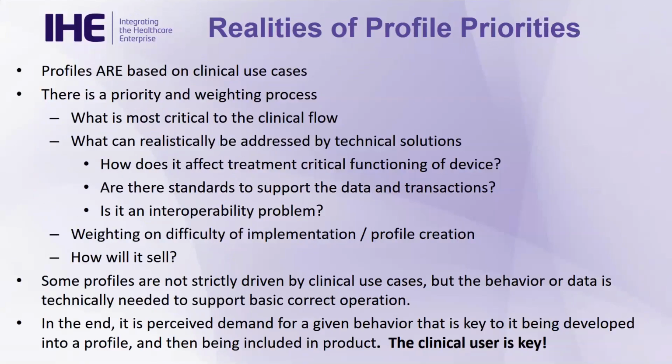This slide, I say reality, is because we can't do everything that we want to do. We do base our profiles on clinical use cases, that input we get. And there is a priority in weighting process, though. Like I said, we simply cannot do everything. So we try to prioritize what we believe is most critical to the clinical workflow. And then we take a look at what can be addressed.